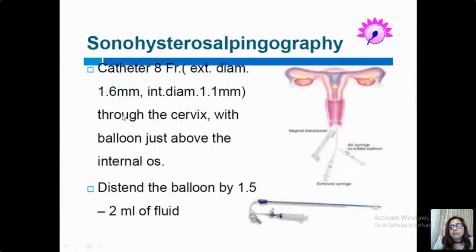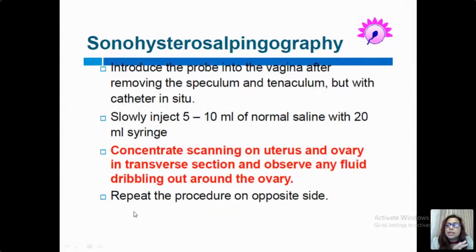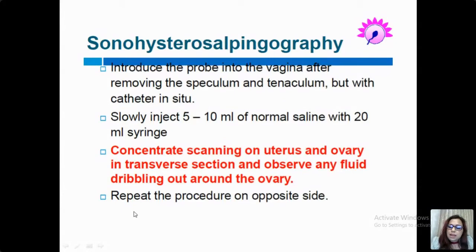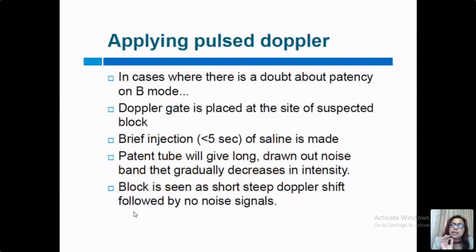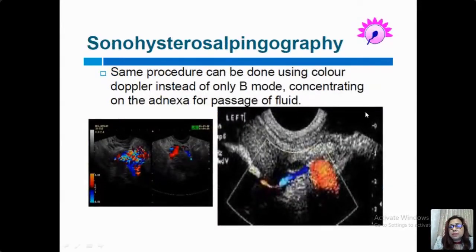For sono-HSG, we use an 8 French catheter inserted just above the level of the internal os; we distend the balloon with water or air and introduce the probe into the vagina after removing the speculum and tenaculum but with the catheter in situ. We slowly inject saline via a 20 ml syringe and scan the uterus and ovary in transverse section, concentrating on one side at a time, observing fluid dribbling out through the ovary. In case of doubt about patency on B-mode, we place a Doppler gate at the suspected site — in a patent tube there is a long drawn noise that gradually decreases, while a block shows a steep Doppler shift followed by no noise. With color Doppler there will be a sudden gush with filling of color in a patent tube.